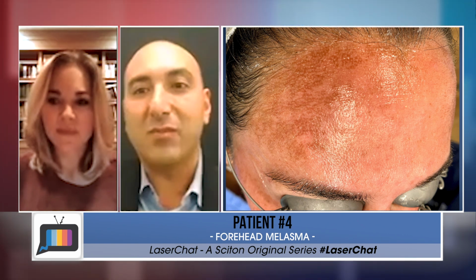Liz, this is my next patient here. She's definitely a young patient, frustrated with pigment that is more than just solar damage, definitely some deeper component, maybe some melasma. And we see this on the lateral forehead of these younger women a lot. She had BBL with me, and it browns up with the BBL treatment, but BBL alone isn't enough. So curious to see how you would approach this patient.